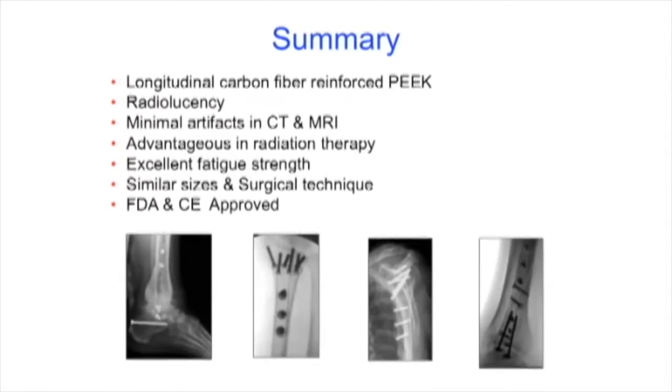Well, the original first generation of wear debris, they were concerned about it going to lymph nodes and causing a reaction. Right now, they've done multiple studies and shown that the wear debris is minimal and doesn't really cause a significant robust inflammatory reaction. There's FDA studies that have actually proven that. And so I think the first generation prior to them coming out with this was concerned. At this point right now, it's no longer concerned as much.